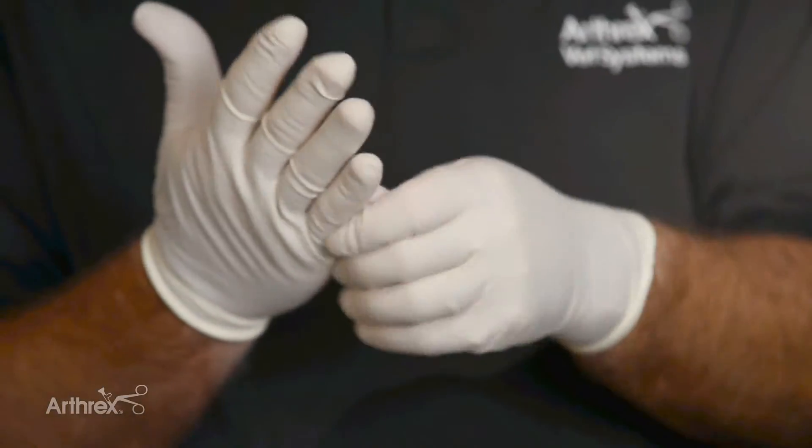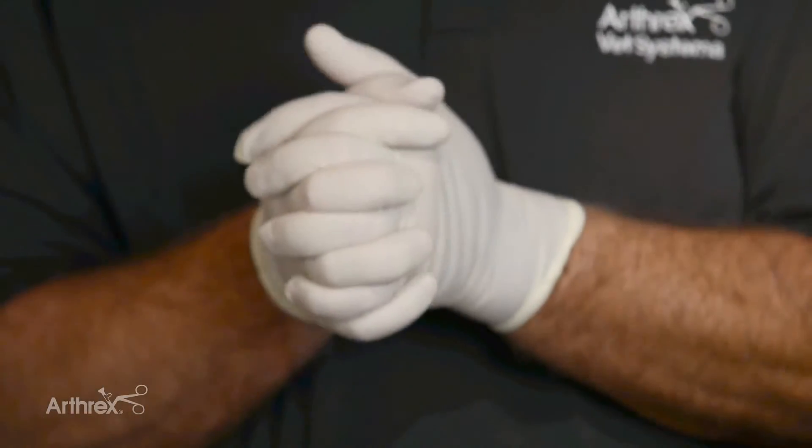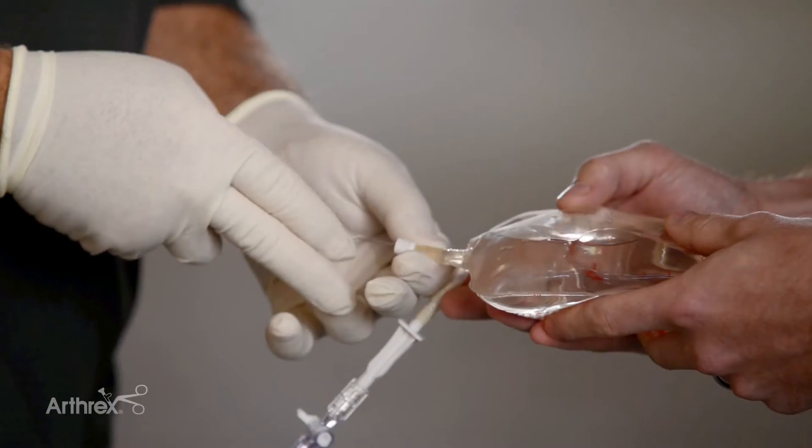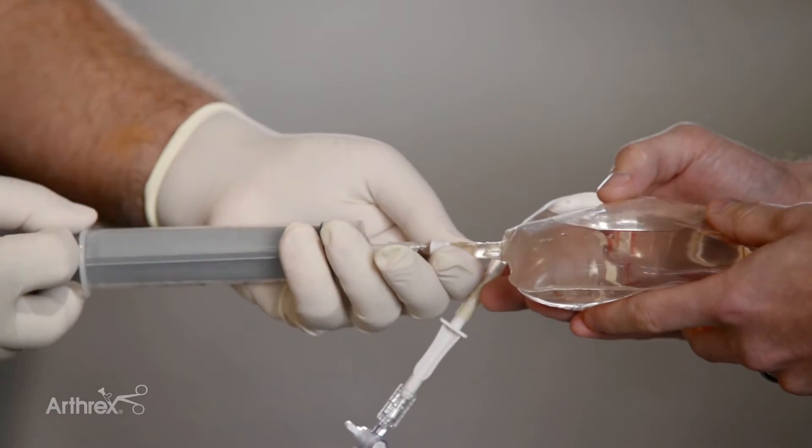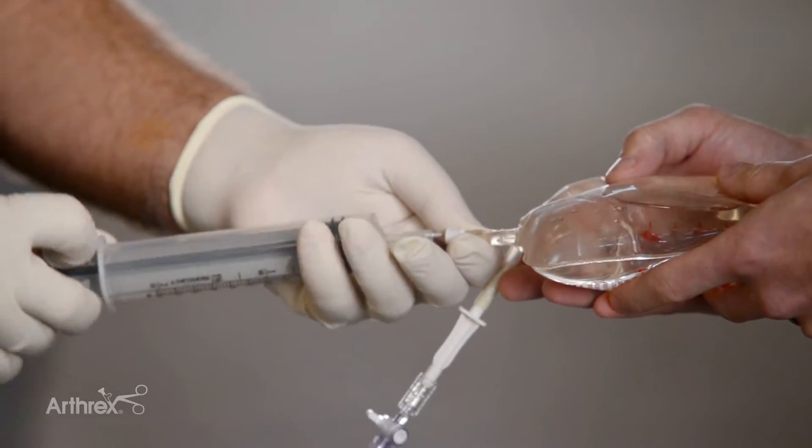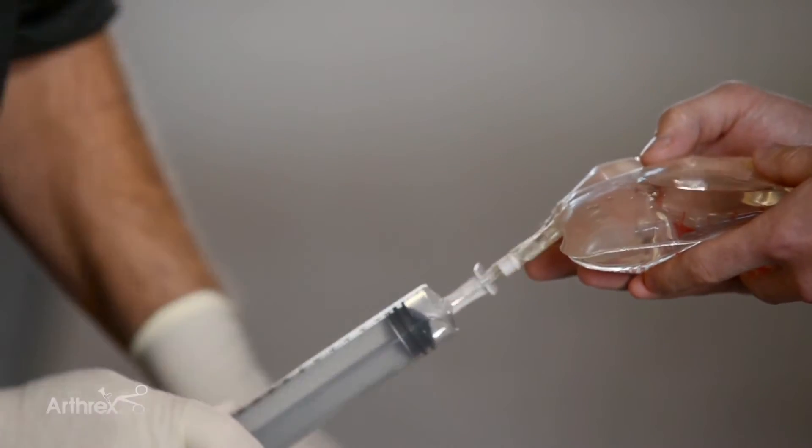With the Angel system we can draw as much as 540 cc's of blood because each cycle we can use up to 180 and we can do that three times. So what we need to do is a ratio of 7 to 1 for the ACDA to whole blood. Seven parts whole blood, one part ACDA.